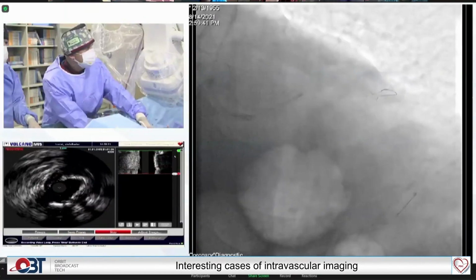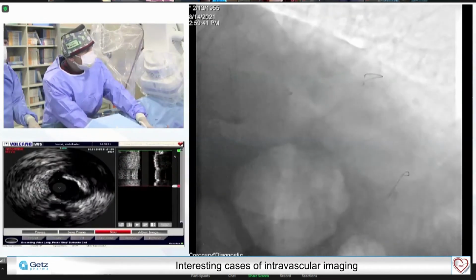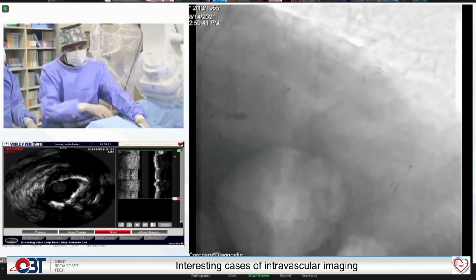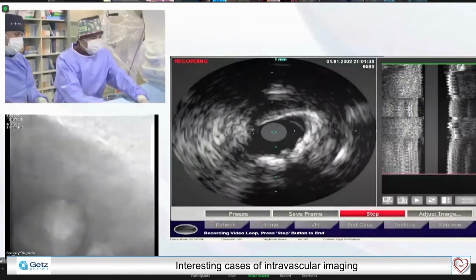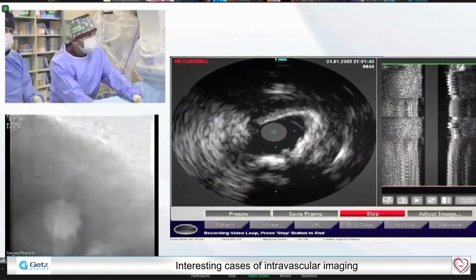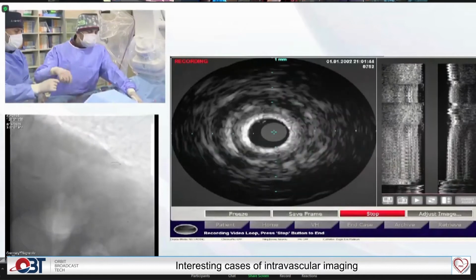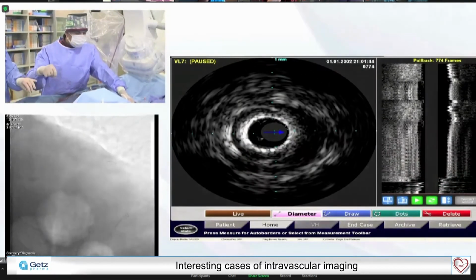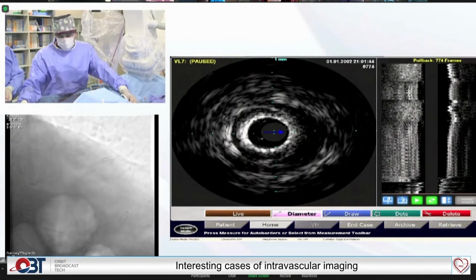Yes, here, I think the diagonal comes through and you see it here, nice. I'm happy here. I have a common ostium, retrograde wire and diagonal wire. So I think I'm in quite a good position. What do you think? I agree that the diagonal should be safe. It looks like lumen distal to the diagonal. Okay.